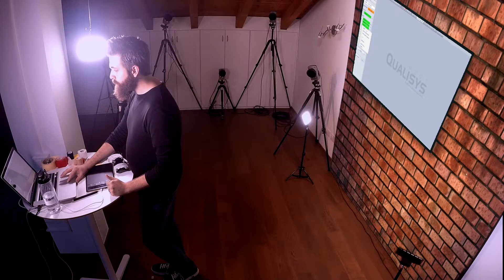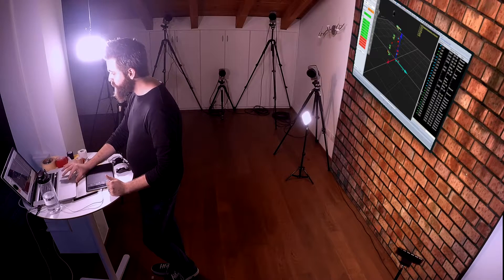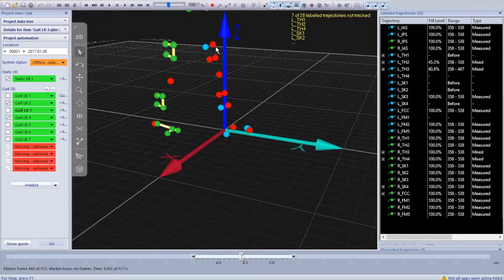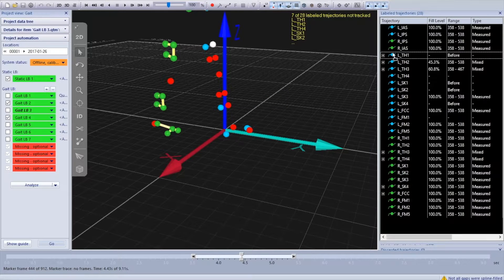Open gait analysis or gait lower body. You'll notice there are several markers that are not labeled. This one, for example, I know for sure is supposed to be LTH1, however it wasn't labeled for whatever reason, so I can just drag it in.